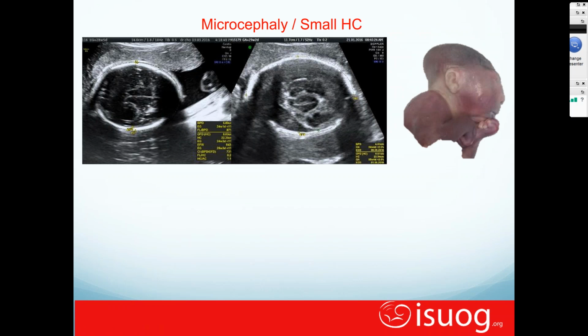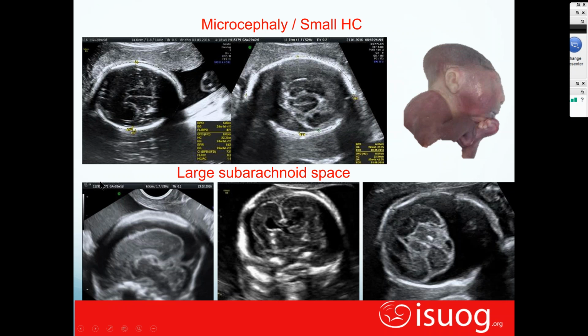Another example, another shape change that occurs if you're looking at it in these babies that catastrophically have microcephaly. They often will have large subarachnoid spaces, and that will compress, and that's where you get some of the brain atrophy that we talk about. And here's some of those examples that you can see here. Here's a 28-week fetus with large subarachnoid fluid, same in the middle one, and then certainly the one on the right, you can see that very clearly showing those changes that are there.